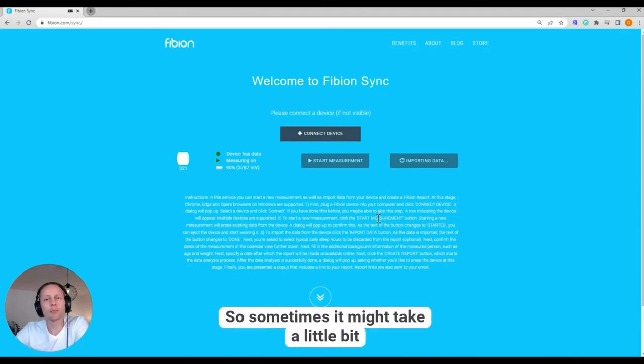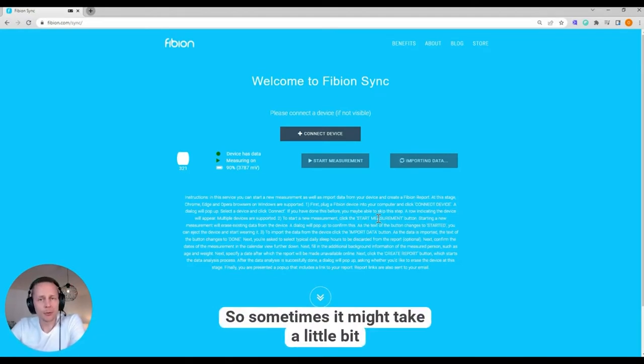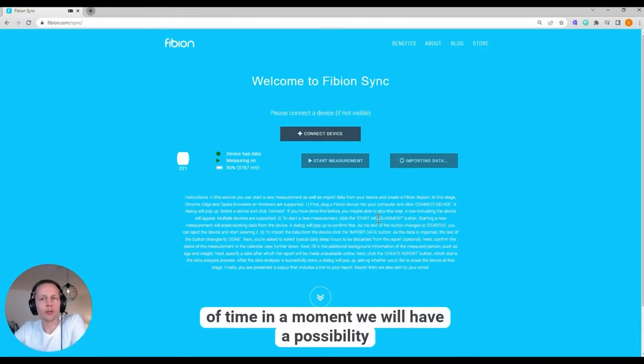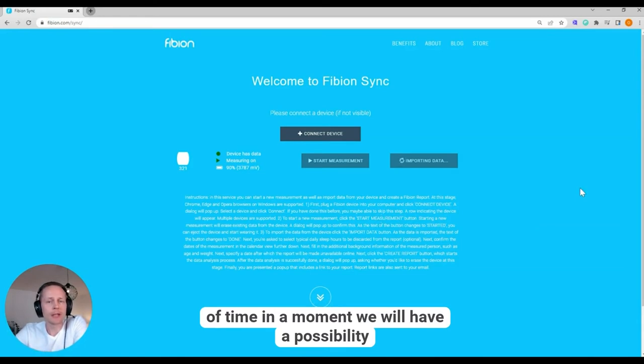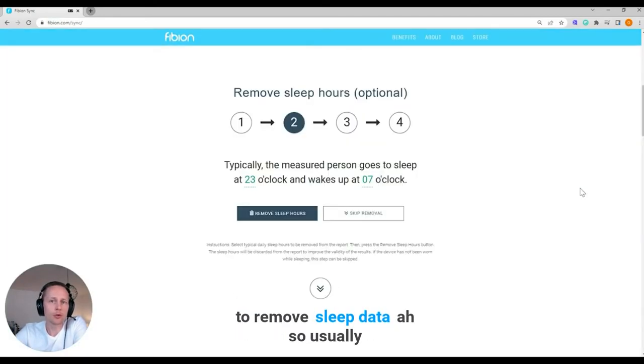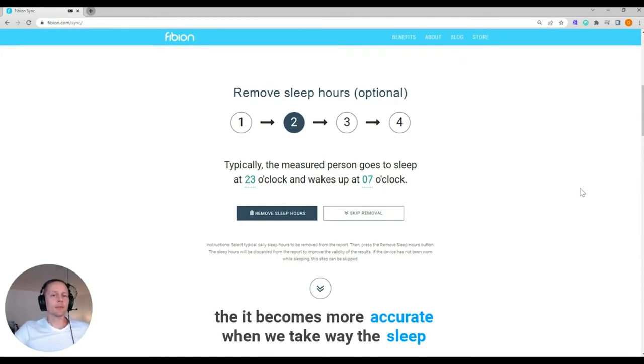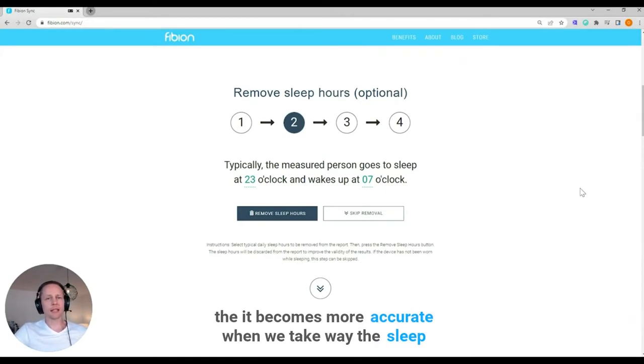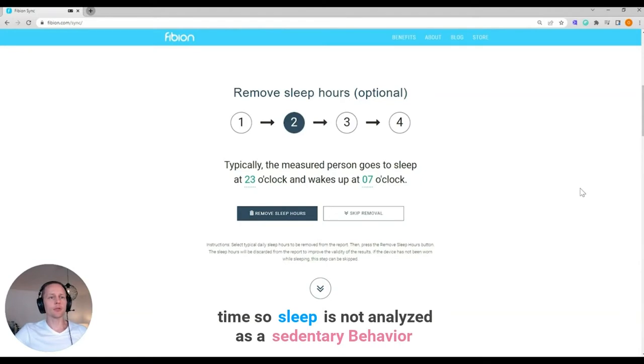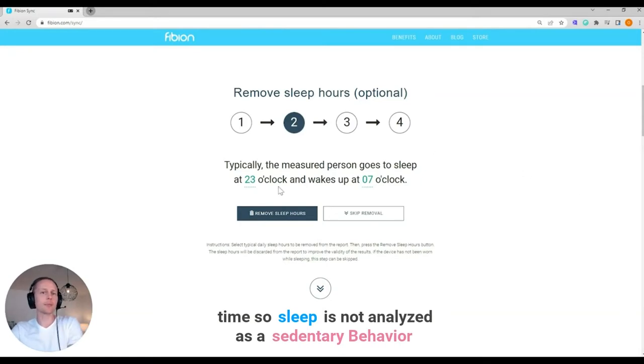So sometimes it might take a little bit of time. In a moment we will have a possibility to remove sleep data. Usually it becomes more accurate when we take away the sleep time. So sleep is not analyzed as a sedentary behavior.